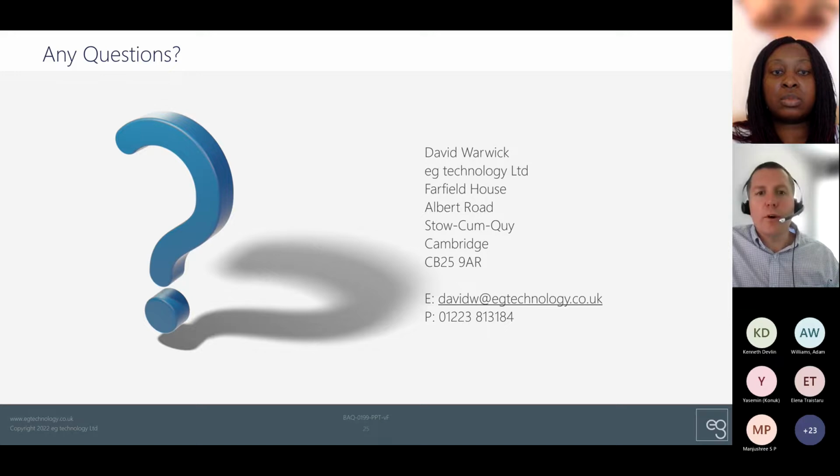There's not a lot of definitive guidance out yet at the moment in that area, but the thing to focus on, I think, is really understanding and controlling the data sets which you use to originally train the system, if we talk about something like machine learning.